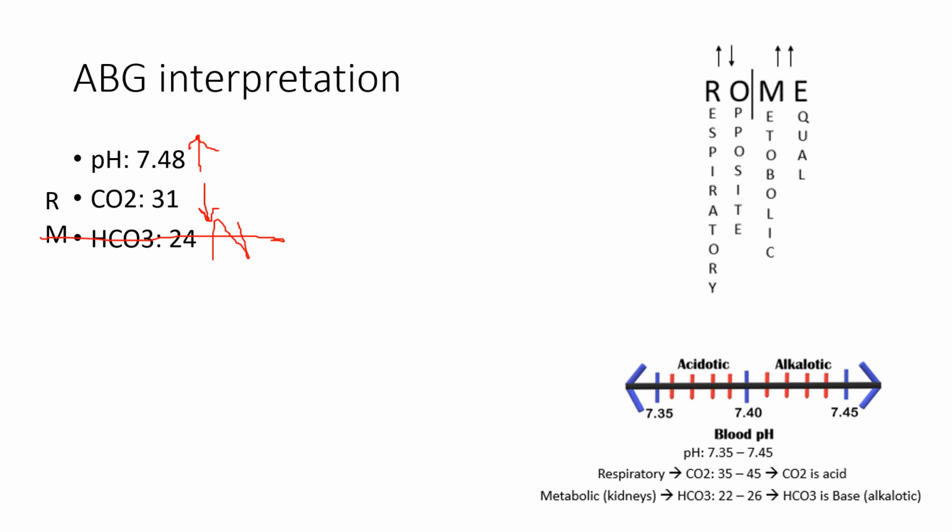This could, again, be hyperventilation. Is your patient super anxious? Are they hiking at a high elevation with poor oxygen? When you're up in the Alps, think elk. So this is respiratory alkalosis, and it's uncompensated because our kidneys are not part of the equation.